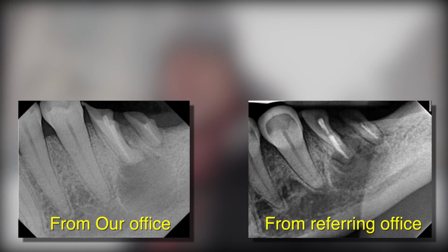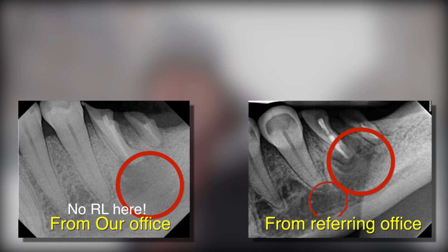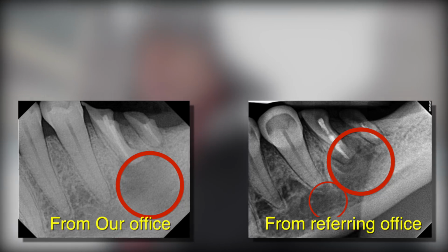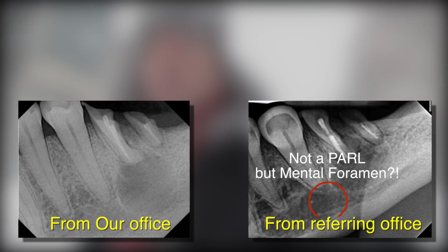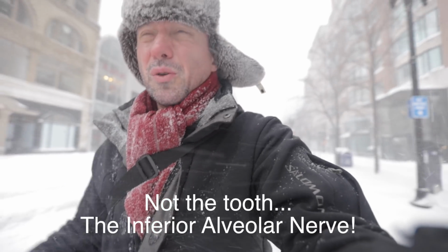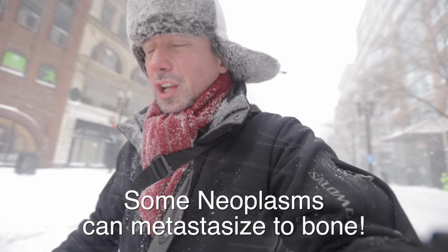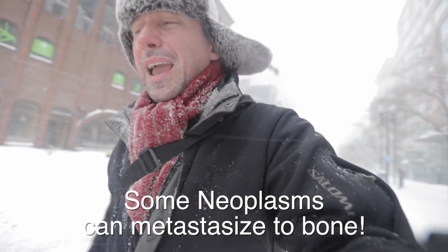Of course, from the radiograph that we saw earlier, you could tell that there is a periapical lesion associated with the roots of the molar that had previous root canal therapy but was not restored. This could potentially be a source of that paresthesia or numbness by placing pressure on the nerve. Paresthesia could also be due to various neoplasms and other pathology of non-odontogenic sources. But in this particular case, the real question was why the premolar was sensitive to percussion and negative to the cold test.